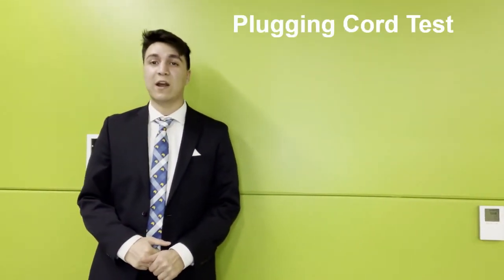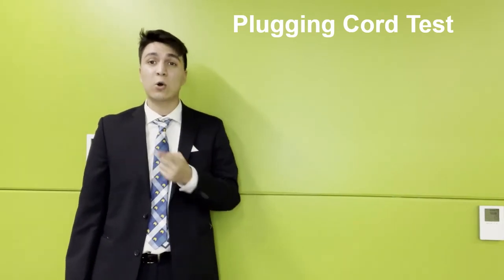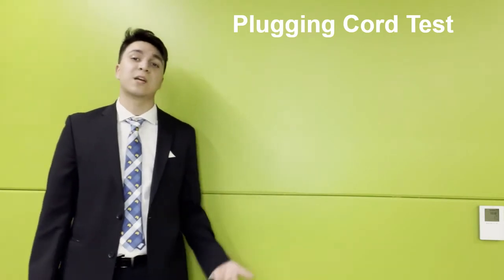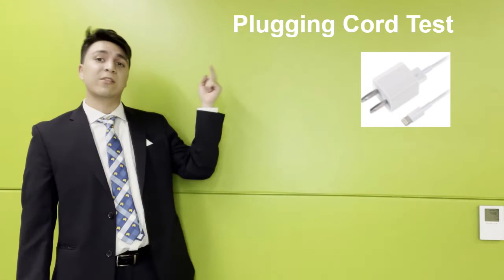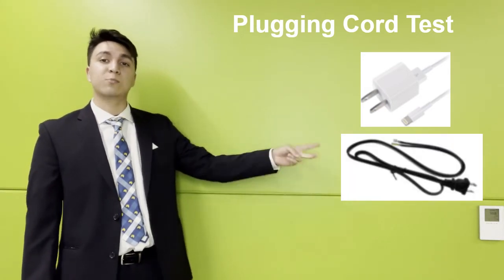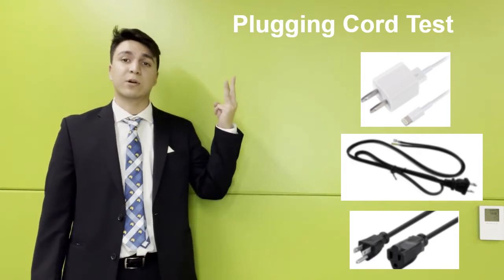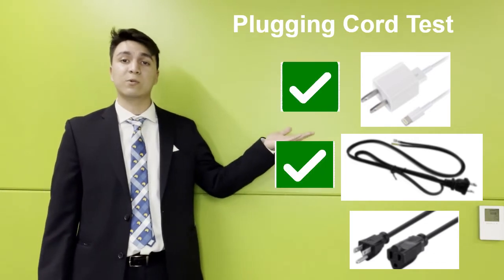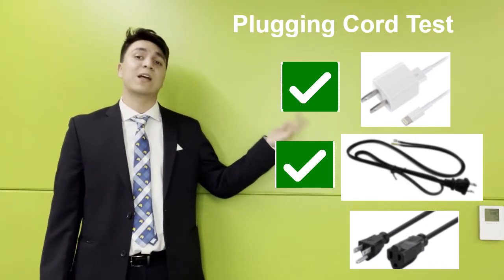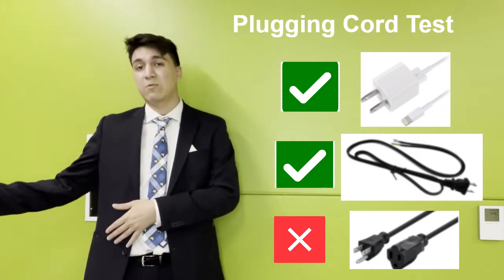Now I want to go over the plugging-in cord test. This test consists of Eric trying to grab three different types of cords and plug each into a wall. Additionally, he had to hold it for 10 seconds before plugging in. The three cords were: a standard iPhone cable, a standard two-prong US household cord, and a three-prong extension cable. The test results concluded that two out of three were successful. The three-prong extension cord caused him to fail — that extra prong gave him so much resistance that he was unable to complete the task.